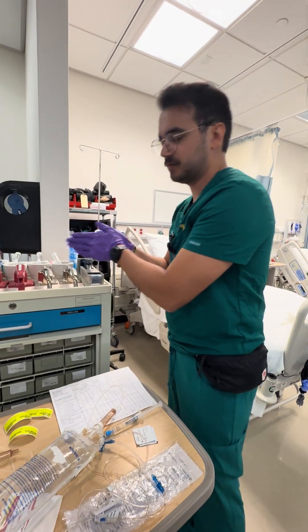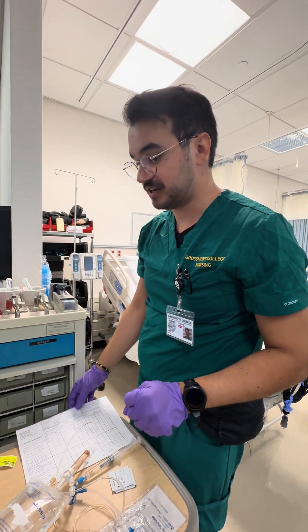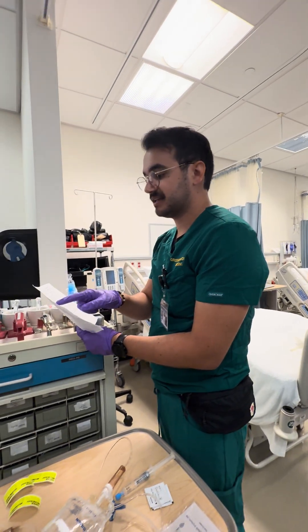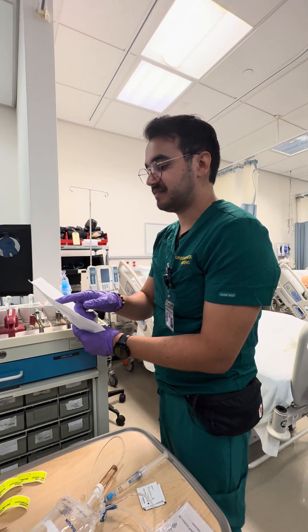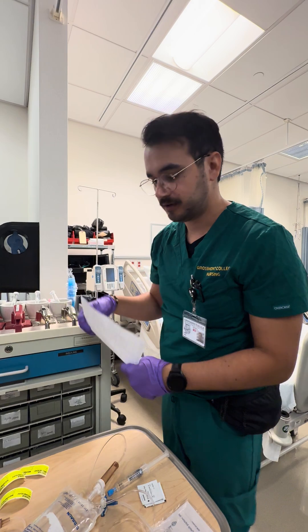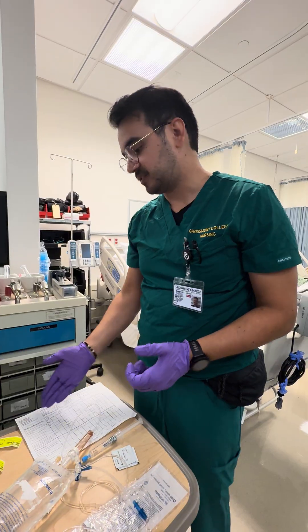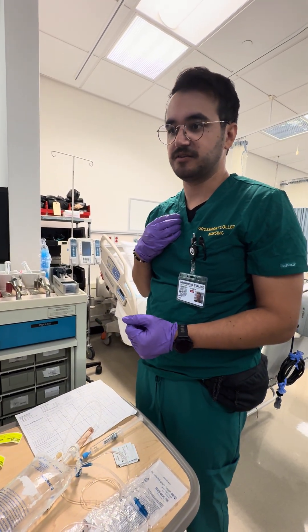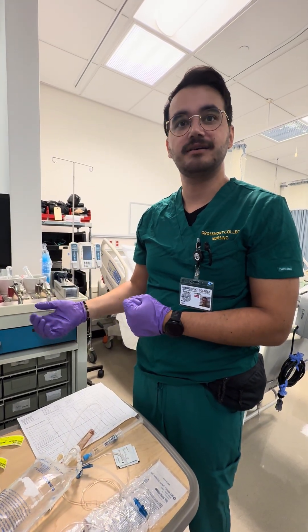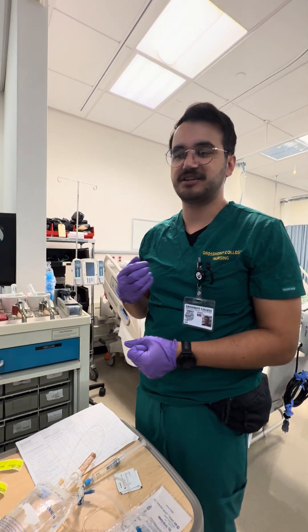Right before we come into the patient's room we're going to do our second MAR check, confirming it's 0.9% normal saline at 100 milliliters an hour IV and cefazolin 2,000 milligrams IV piggyback infused over 60 minutes. As a quick review: normal saline is a crystalloid fluid, it's isotonic, and we're giving it to help maintain hydration. Cefazolin is a first-generation cephalosporin antibiotic used to combat bacterial infection.